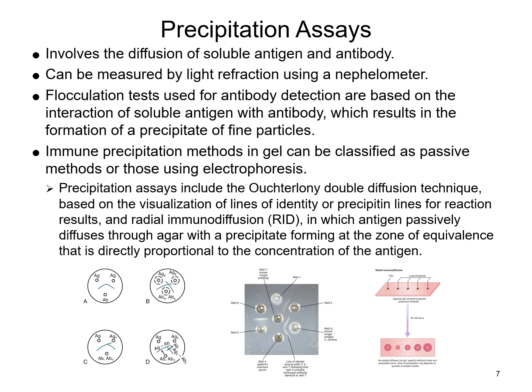You may still see some of these test methods in some labs, or you may find them now just more in your reference labs. So most of what you may actually see for this particular method would be using gel electrophoresis. Now there are a couple of older methods, the radial immunodiffusion as well as the Ouchterlony methods that are often used that use that gel component. We're not going to go a lot into these, just know that these are some of the older methods that actually use that agar, and what it's basically doing is looking for that antigen antibody complex to diffuse throughout that gel media, and so that's basically what you're looking for, is those zones, and you would measure those zones actually looking for that reaction taking place in that gel agar.